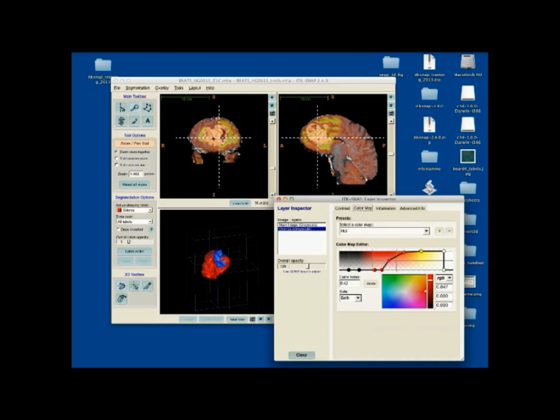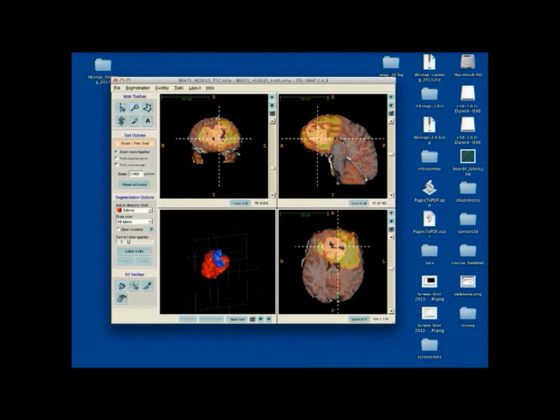In the next version we're going to make this a little bit more intuitive, but right now you kind of have to play with the contrast as well as change the color map to achieve this kind of effect of a semi-transparent overlay where only a portion of it is highlighted. So it gets a little busy with the colors if I try to show an overlay and a segmentation and an image underneath, but it's kind of doable.